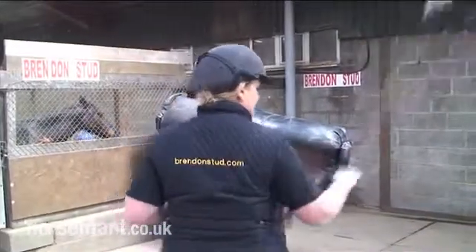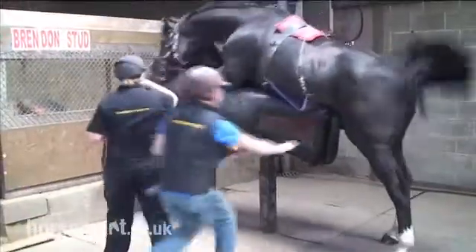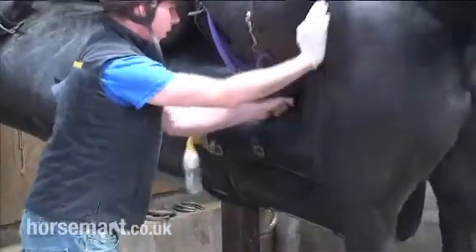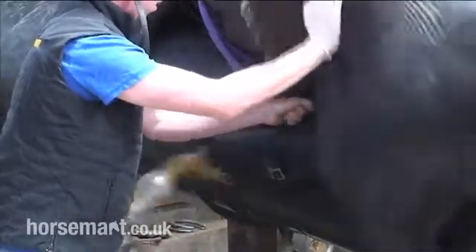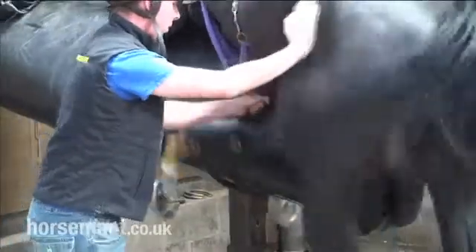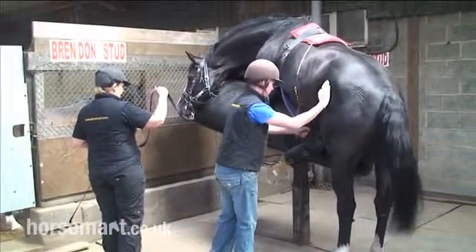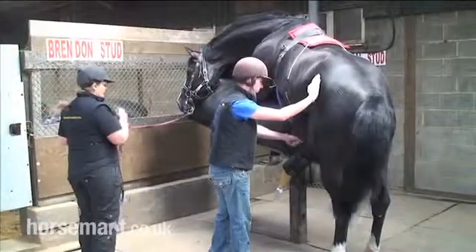You can see that Shirley's wearing a hard hat, as is Jim who is collecting the semen. He wears steel toe cap boots in case he gets stepped on, and he places the artificial vagina over the stallion's penis. The stallion ejaculates after approximately 30 seconds into the collection vial.